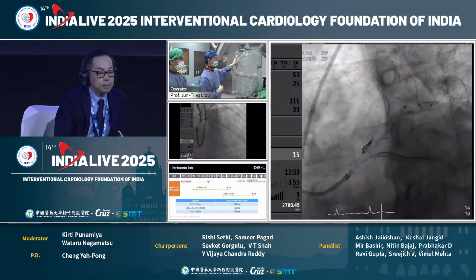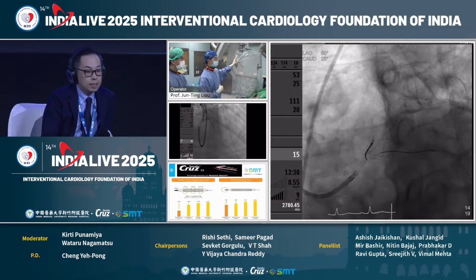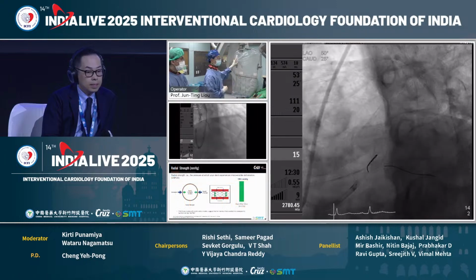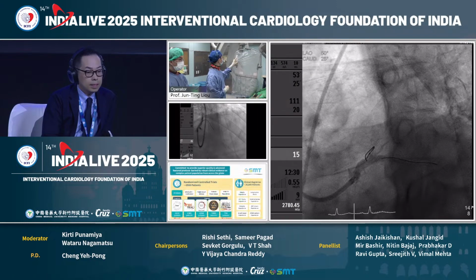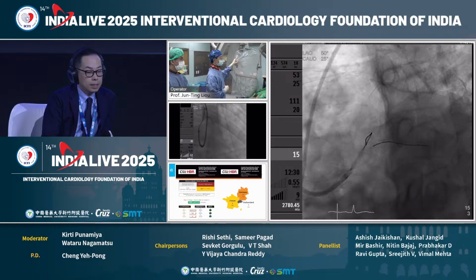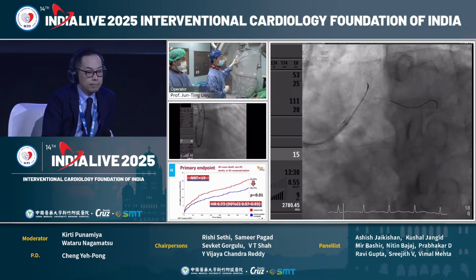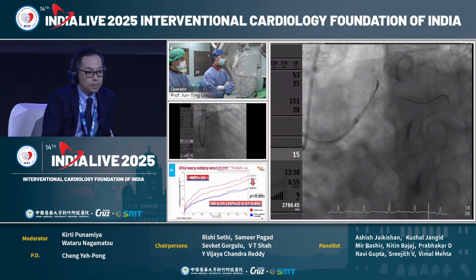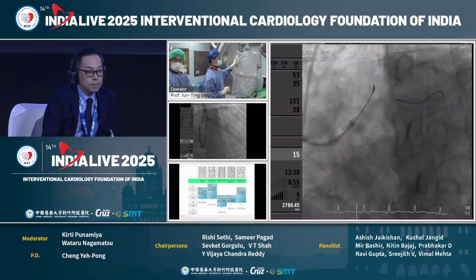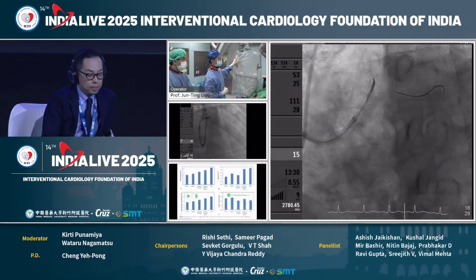channel. And to facilitate device crossing, the stent cover on the ostium of the LAD, we use a small balloon dilatation of the LAD ostium with a 2.0 balloon to open the LAD ostium. And then we bring down the microcatheter Corsair Pro, and we make a tip injection. However, there is still no integrated microchannel.